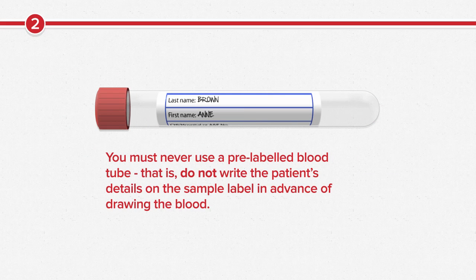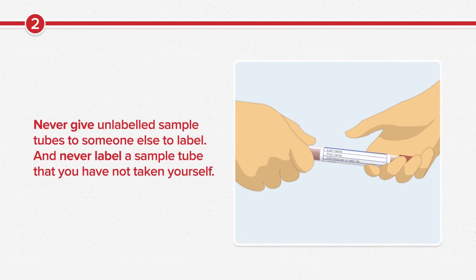You must never use a pre-labelled blood tube. That is, do not write the patient's details on the sample label in advance of drawing the blood. Never give unlabelled sample tubes to someone else to label, and never label a sample tube that you've not taken yourself.